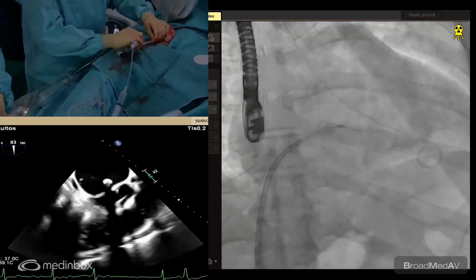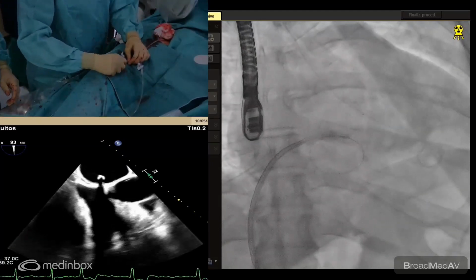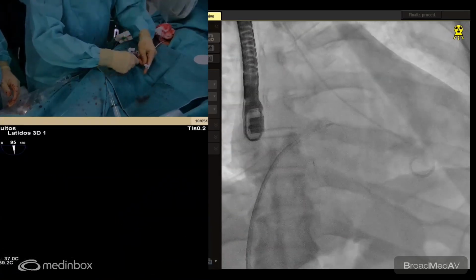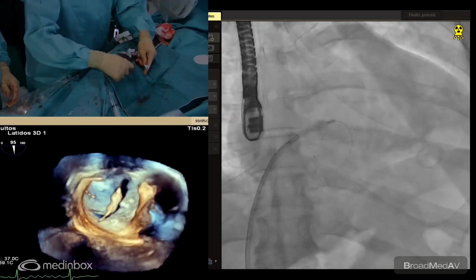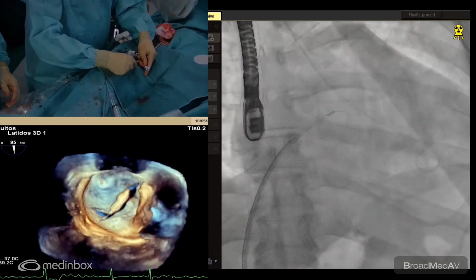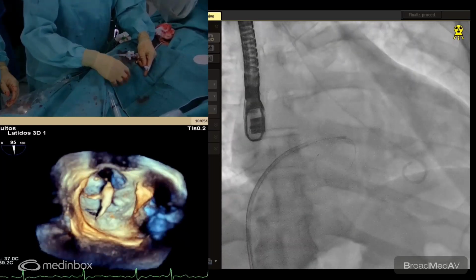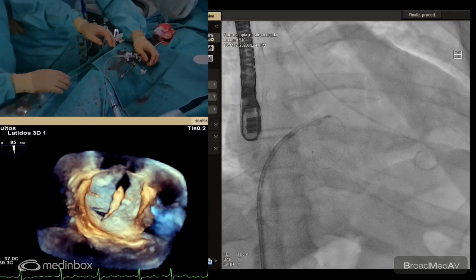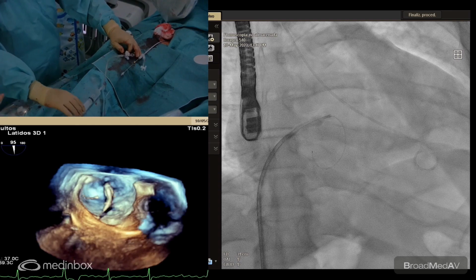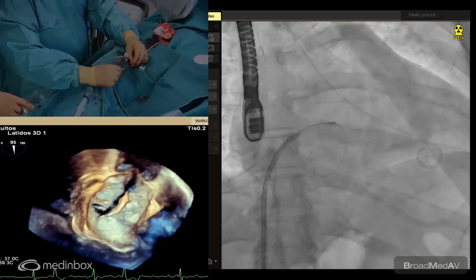I think we need to deflate the balloon better. Mete el plateado. Mete el plateado, si no, no te irá hacia arriba. Okay. We need to advance the stretch tube. It's inflated, the balloon. You are seeing, okay. So, Guillermo, yours. Sujetarlo un poquito ahí. Bueno, vamos a esto. So we need to deflate the balloon better, and then the steps are similar to before.